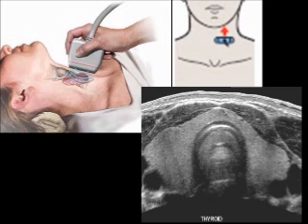And the same way as in the abdomen, we can use ultrasound to scan the thyroid. Here is a patient. We are using the probe to scan the thyroid, and this is an ultrasound image. We can nicely see the thyroid, right lobe, isthmus, left lobe, and these are the carotid vessels. These are the neck muscles, and this is the subcutaneous tissue.